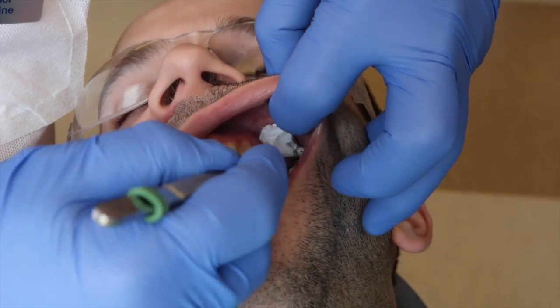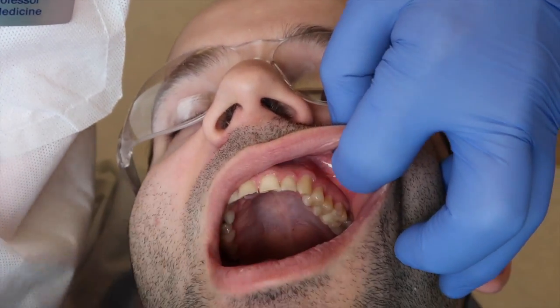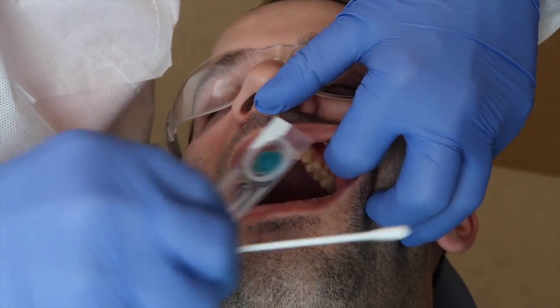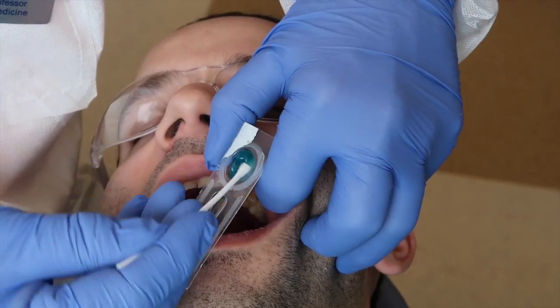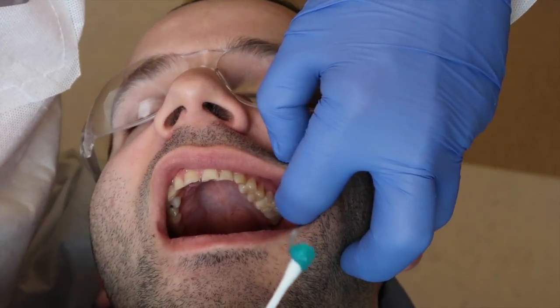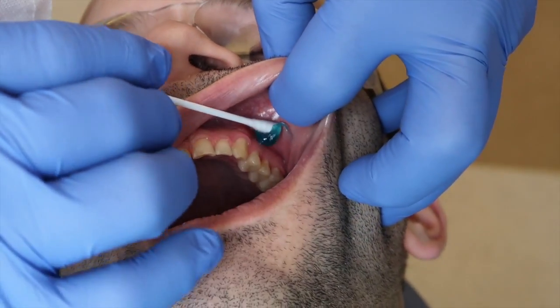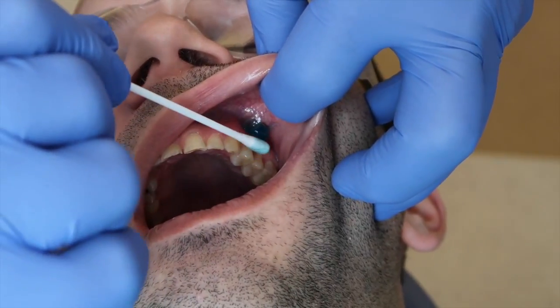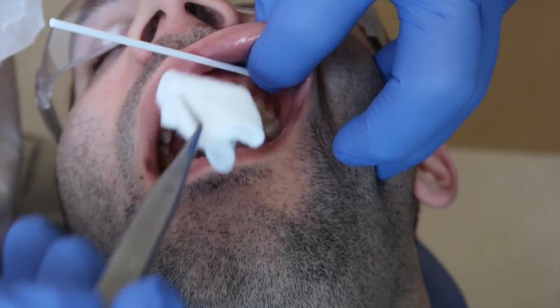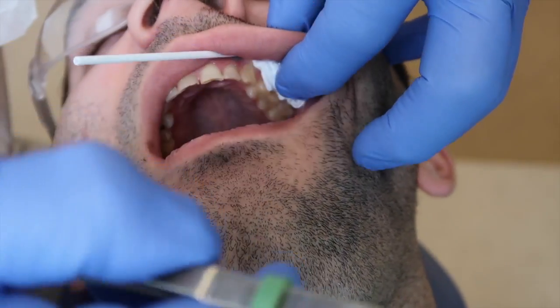I want to dry the area so the topical doesn't spread all over the place. I want that topical anesthetic to be on one side of that Q-tip, and I'm going to place it right there, then to ensure it stays where I want it, put a piece of two-by-two folded twice over and have the patient close.